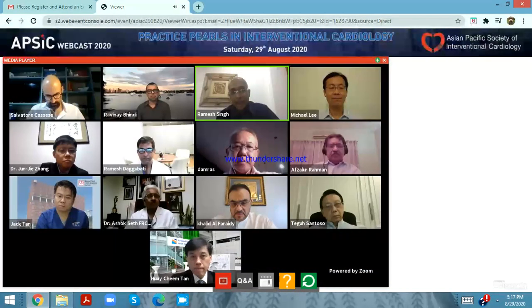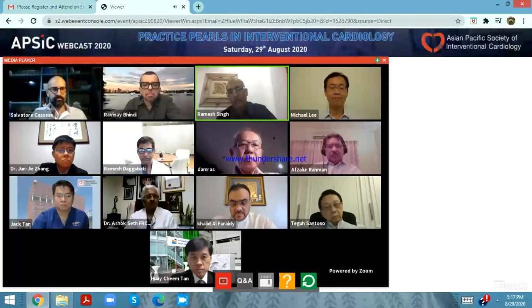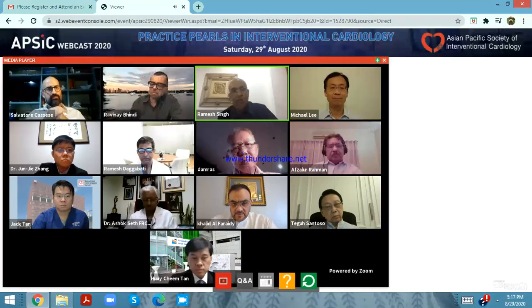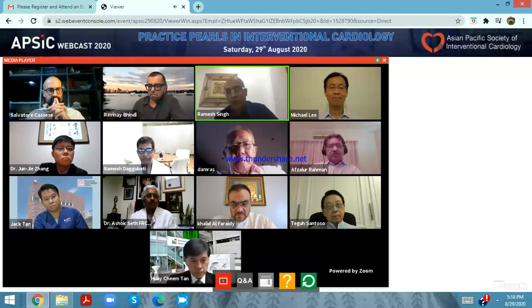I believe, and I think I've heard your lectures before, I don't think you've had any significant perforations with this device before. I also believe that you use quite a bit of OCT or imaging to guide your balloon size, and I understand your ratio is 1:1. Now, my concern is, will I be able to cut my cost and not use imaging? If there is an indication to use IVL, do you think it's safe enough? And do you think I can safely size it according to the angiogram, a 1:1 ratio? Do you think that's advisable?